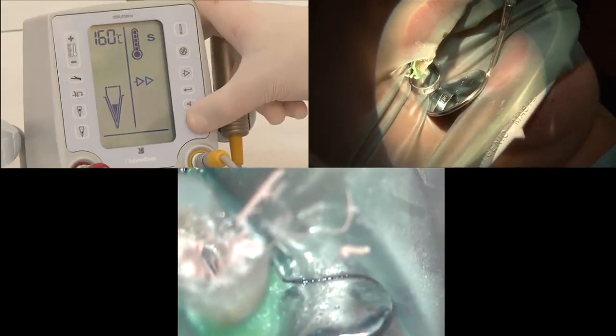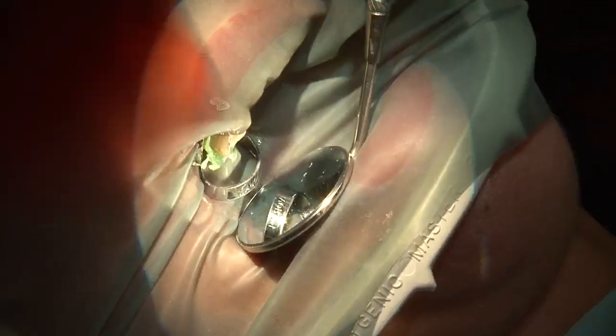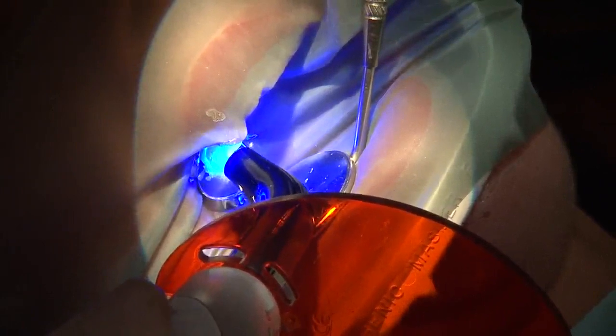The cure light is used for 40 seconds to achieve immediate coronal seal of my obturation material. A bit of composite is being used as temporary material before the final restoration is made.